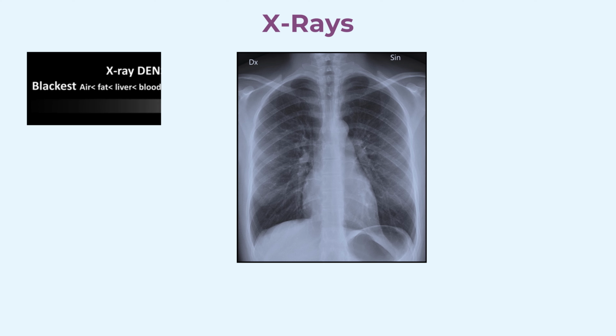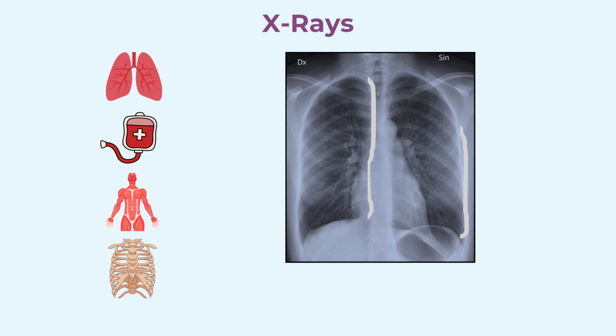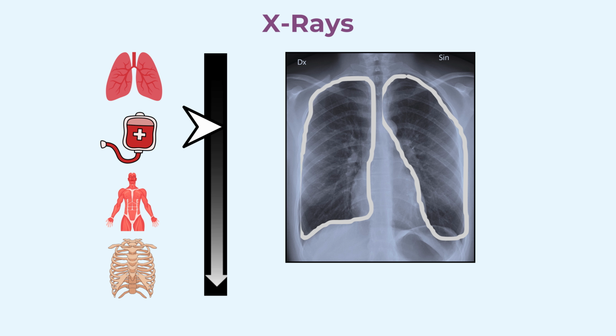Conventional X-rays, with their iconic white bones on a black background, are much like photographic negatives. The darkest areas are where photons pass freely through soft tissues and air, while the bright, sharp whites mark denser structures like bones, where photons are blocked.